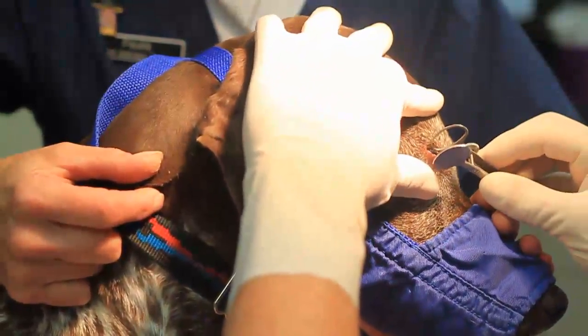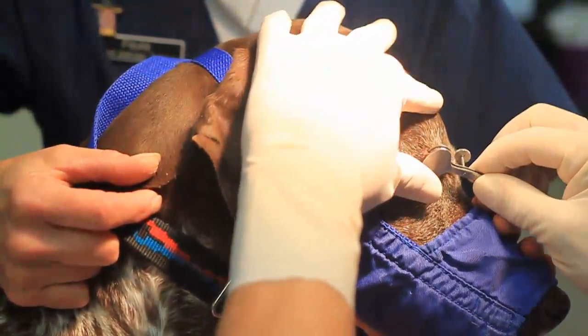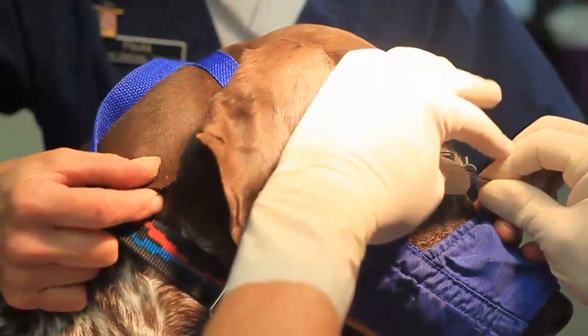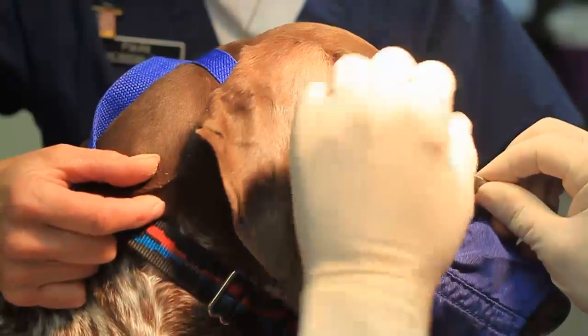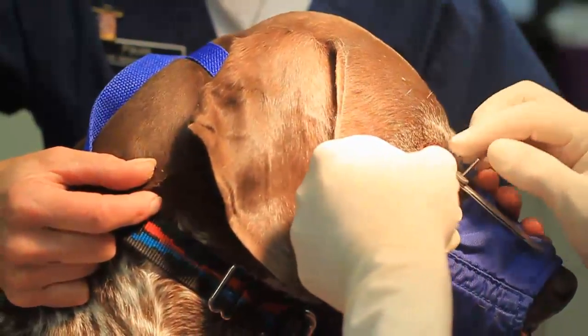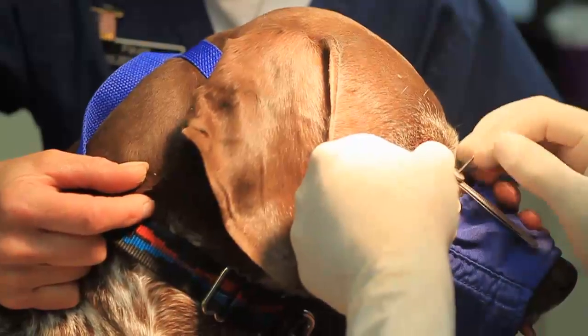I'm going to put the chalazion forcep on here and then we'll tighten up. I always muzzle anything that's done with a local — I don't want to take any chance that the person holding or the veterinarian could get bit. My rule of thumb is anytime we're doing something with a local, the muzzle is on. This dog is not a nasty dog; it's a really nice dog.